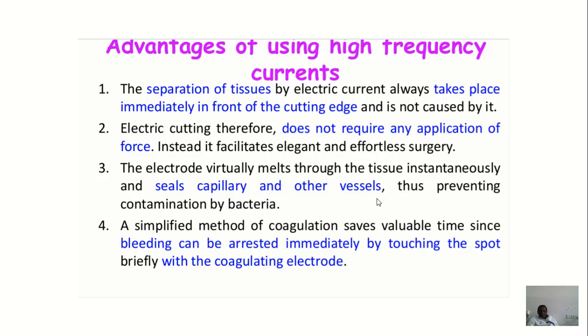Now we can see the advantages of using high frequency current. I told you low frequency current is not used in diathermy, only high frequency currents. What is the advantage? The separation of tissues by electric current always takes place immediately in front of the cutting edge and is not caused by it.